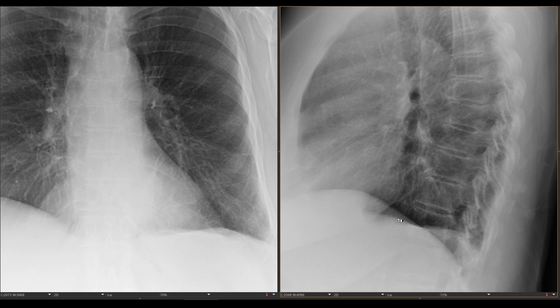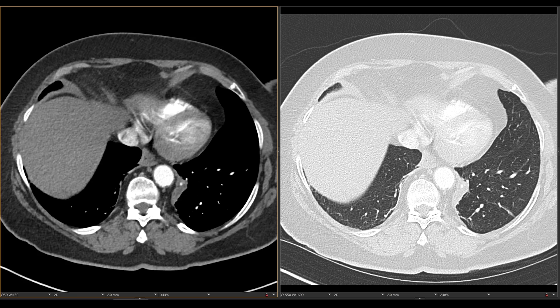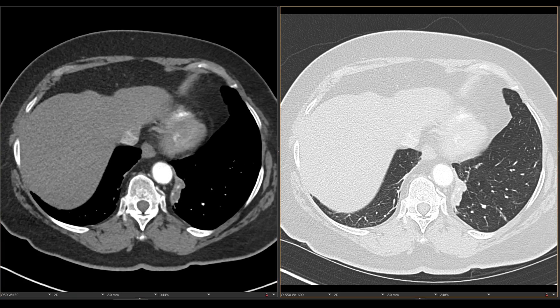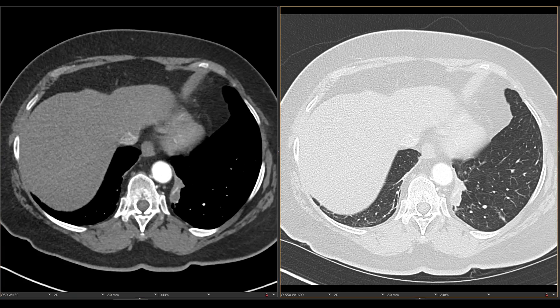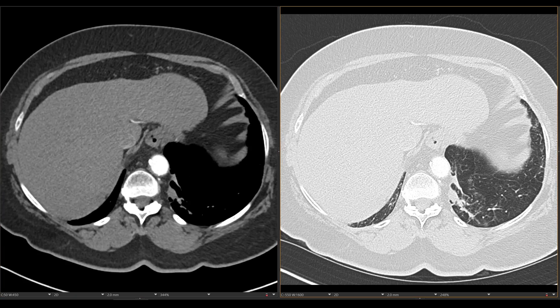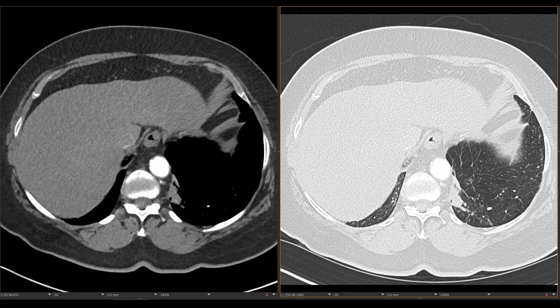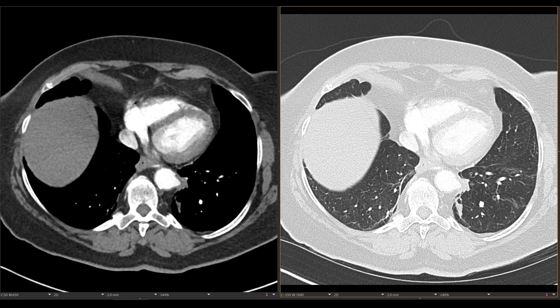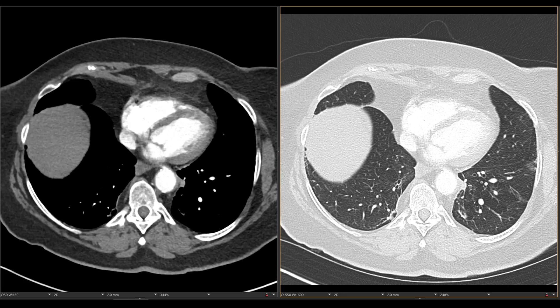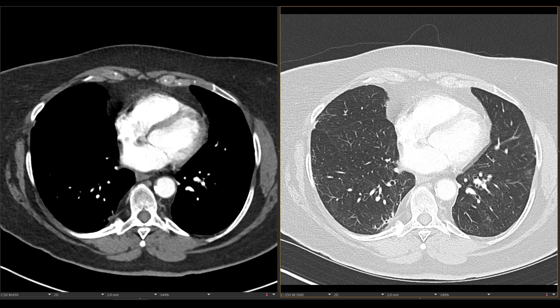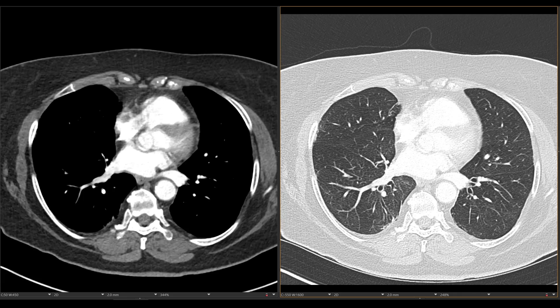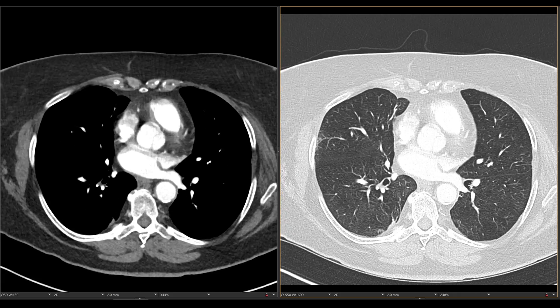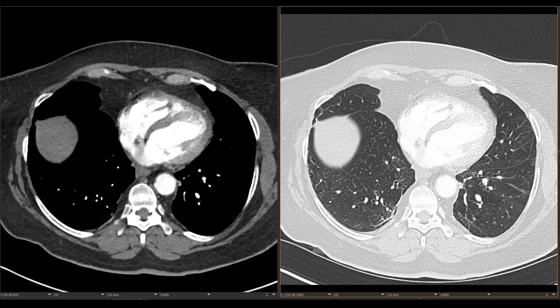This patient wasn't having any symptoms of pneumonia, so a chest CT was done. When we look at this area on CT, it shows up as an area of consolidation and volume loss in the left lower lobe. And you can see that it abuts the aorta, so it's easy to understand why it would obscure the descending aorta on the chest radiograph.